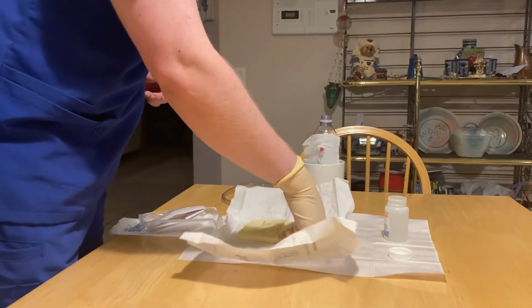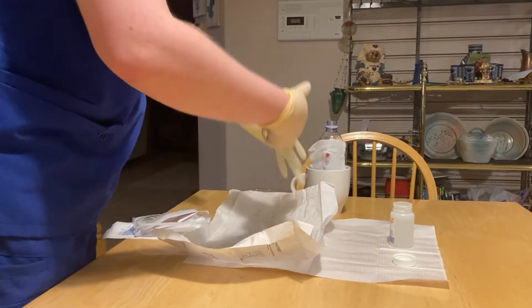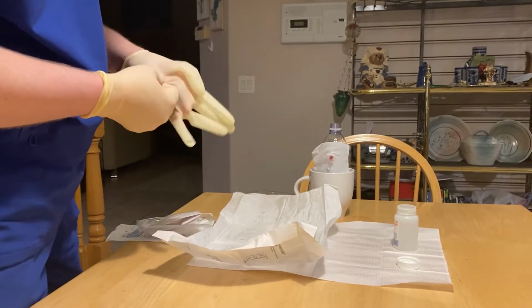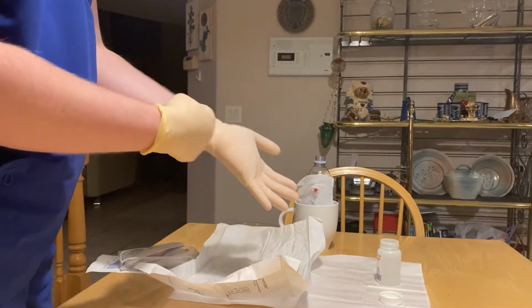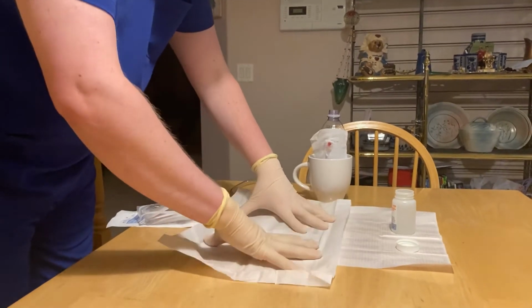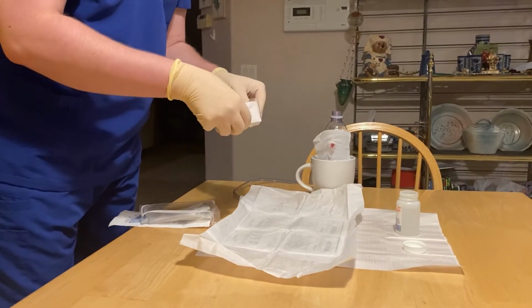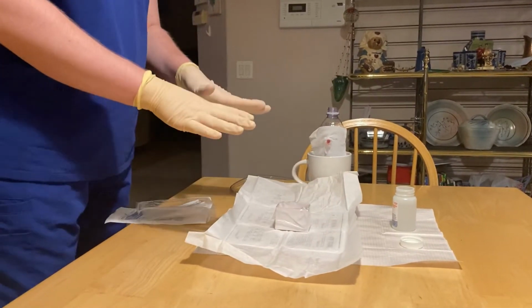One glove on. Next glove on. Now I can fix them because they're sterile. Okay, so then I have this as a sterile field that I can set things on if I need to. So I would then take out this little box, open it up, and leave it in. Put it on here, it's still sterile.